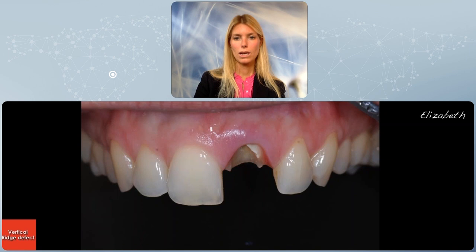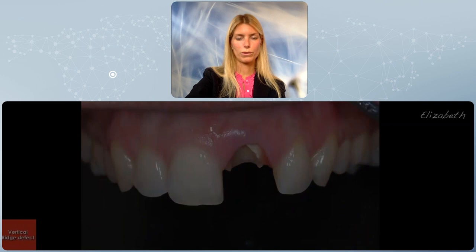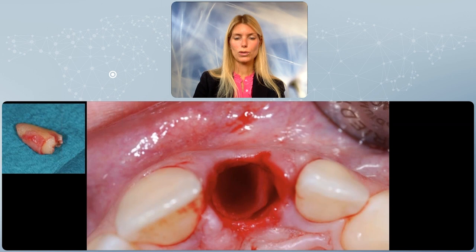If I had performed an immediate implant, the risk of a buccal recession would have been extremely high, and I do not like taking risks. When the tooth is extracted in a very atraumatic way, the buccal portion was ankylosed to the cortical buccal wall, and almost three quarters of the root was covered by the buccal bone, which meant that the alveolar socket was now left with only three walls instead of four.